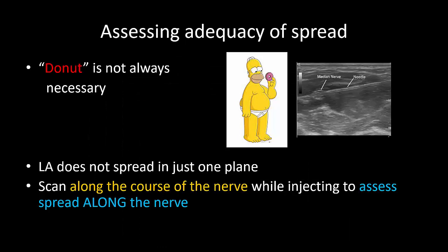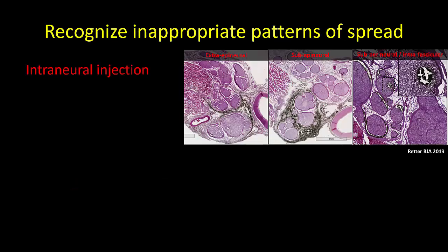Repositioning to achieve circumferential spread is not always needed. Remember that the local anesthetic does not just spread in one cross-sectional plane but travels up and down along the nerve. So scan along the course of the nerve while injecting to assess the spread and where the local anesthetic is going before deciding if you actually need to reposition the needle tip. Finally, it is just as important to recognize inappropriate local anesthetic spread. I do not recommend deliberate intraneural injection, which for me means any injection beneath the epineurium.